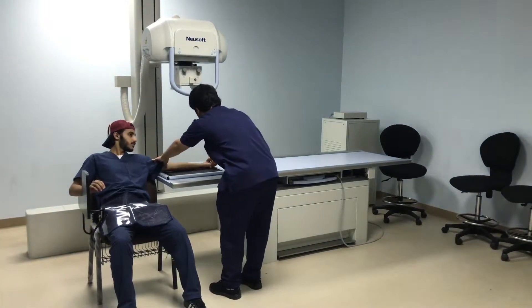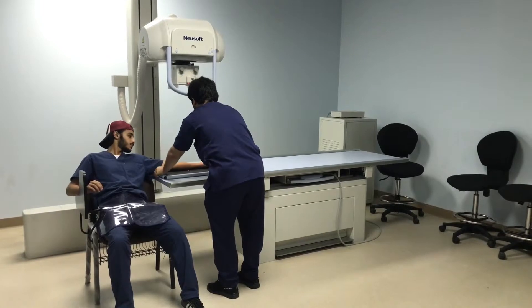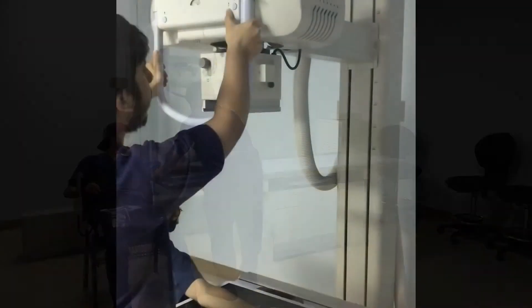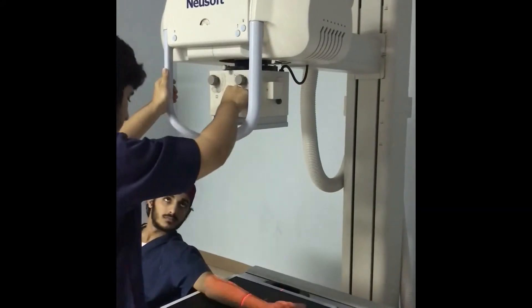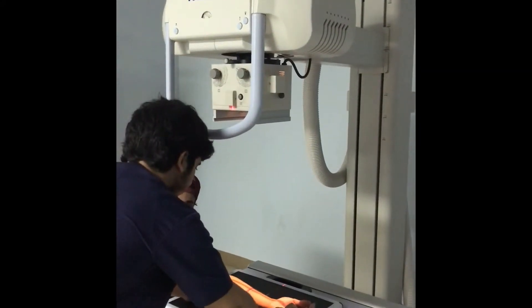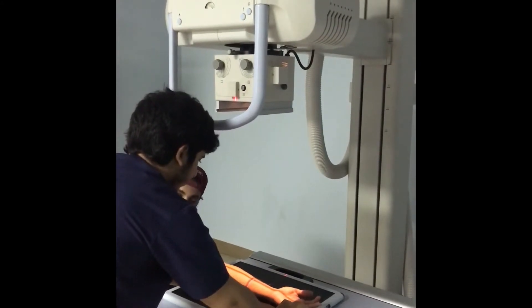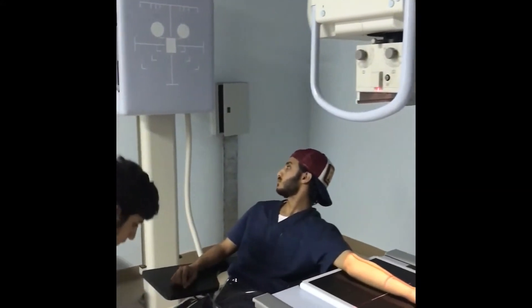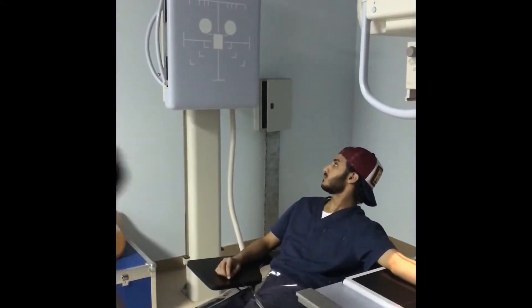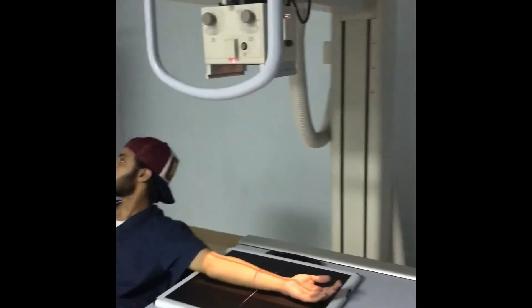The specialist adjusts the patient's forearm to perform the examination. He drops the patient's shoulder to place the entire upper limb on the same horizontal plane. Also, the specialist makes sure that the tube is 100 cm distance away from the receptor, aligns the center forearm with the long axis of the image receptor, and makes sure that both the elbow and wrist joints are included. The center ray should be perpendicular to the mid forearm.